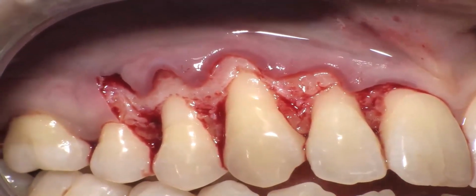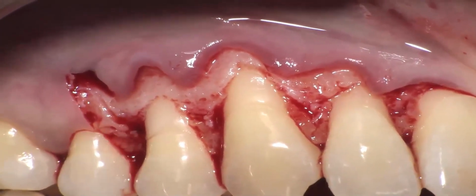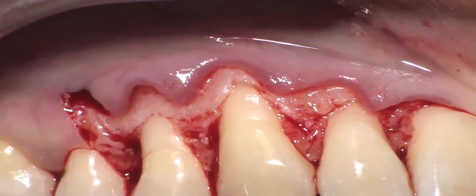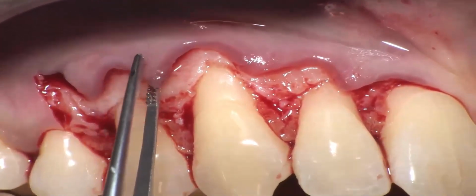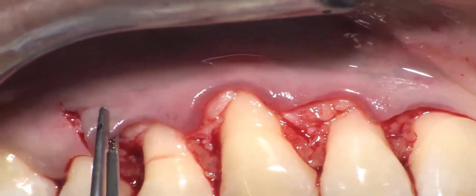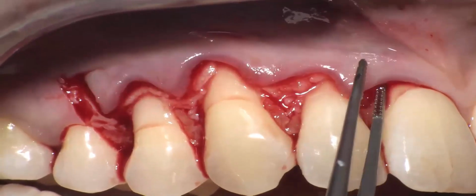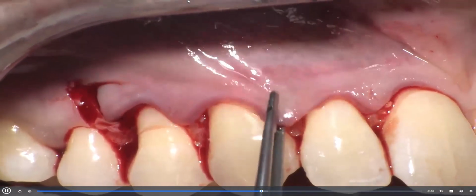Both in this area it's connective tissue until the papilla, and the connective tissue is completely free from epithelium, so we will place our surgical papilla above the anatomic papilla, and in such a way all gingival recessions will be covered.